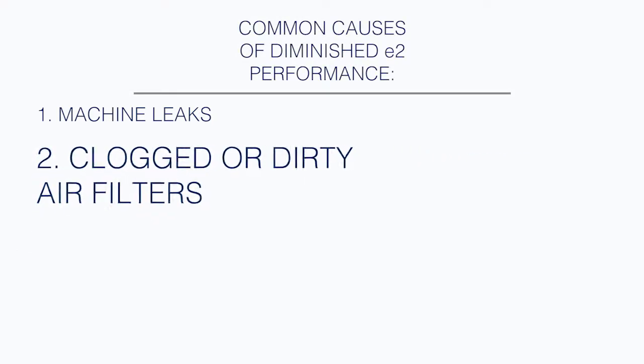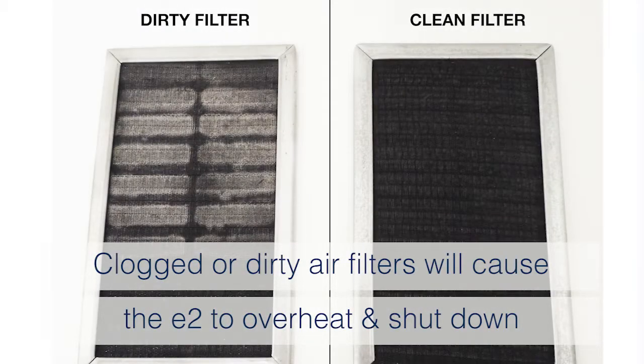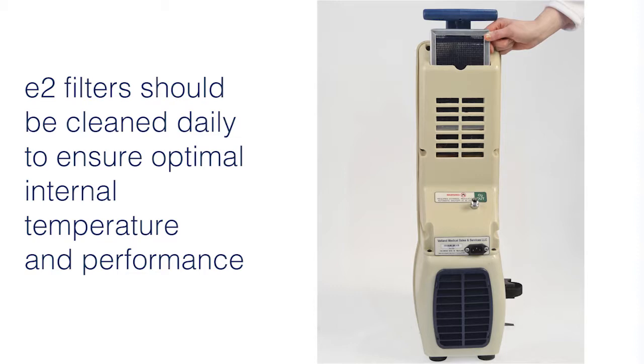Clogged or dirty air filters. Clogged or dirty air filters will cause the E2 to potentially overheat and shut down during use. Filters should be cleaned daily to ensure optimal internal temperature and performance.